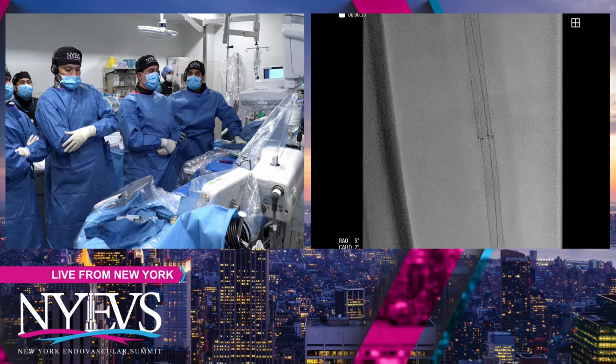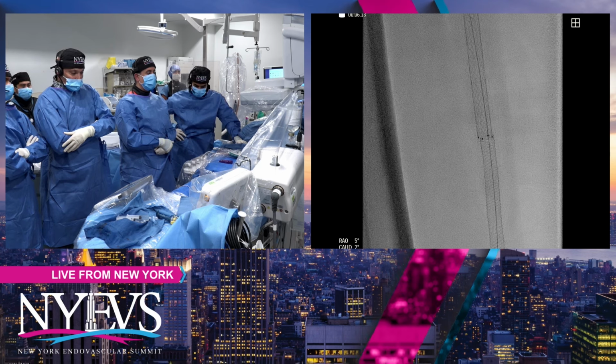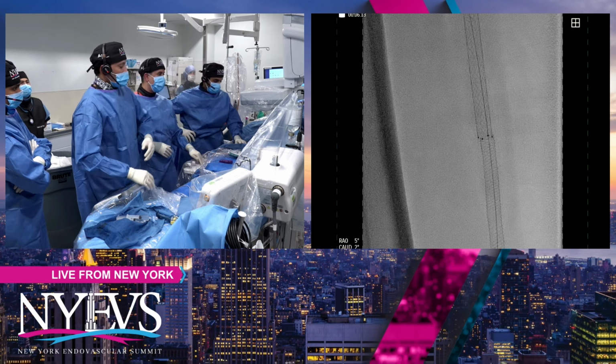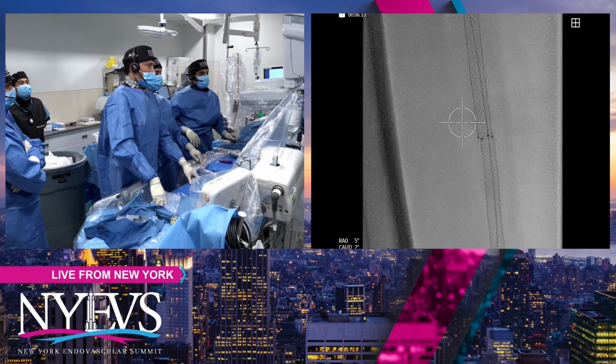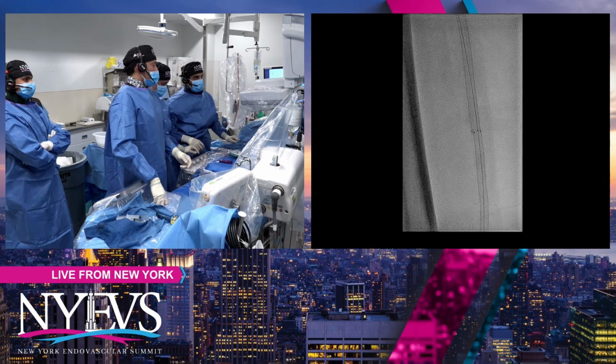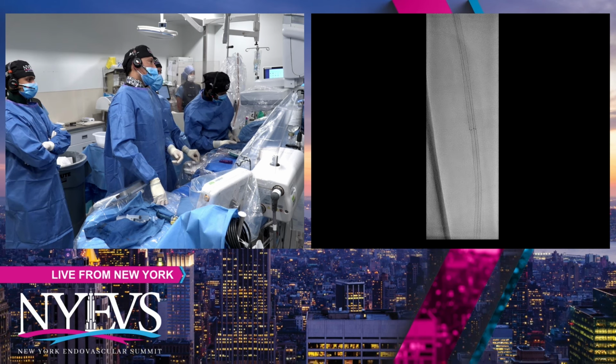Karthik, if you do have a chance to do a flexion, it would be really interesting to see the separation of those stents on flexion. I'm not sure if it's appropriate right now, if the wire and the filter is in, but just on plain fluoroscopy to see if there's actually a kink or an association of the stent in that area.